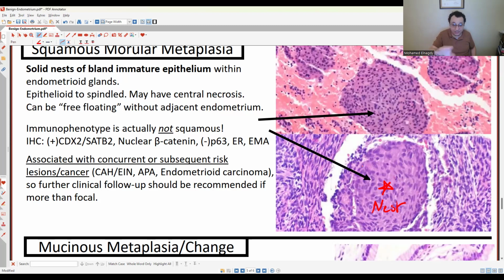The last thing that you said is very good. These cell borders: they look very cohesive, but still there are borders between the cells, because squamous cells always attach together by tight junctions. So you will see intercellular bridging or intercellular borders. And you mentioned rounded to ovoid polyhedral nuclei and pink cytoplasm, and the cells are usually cohesive, forming a nest with tightly packed cell borders.